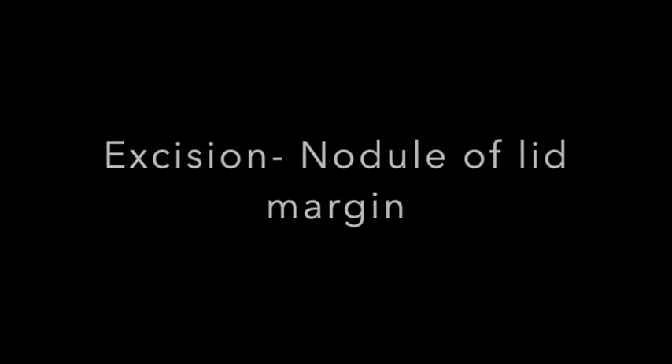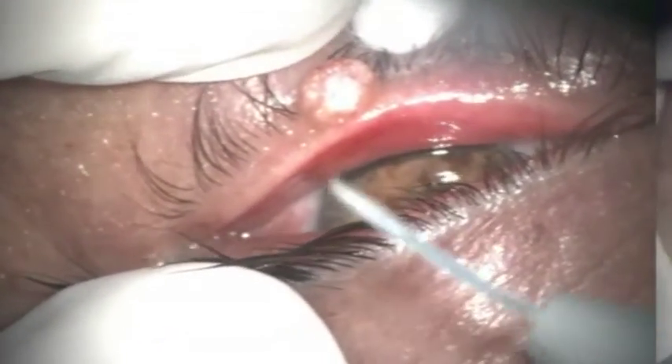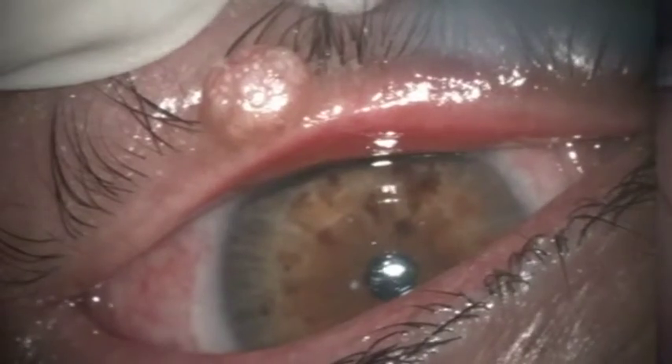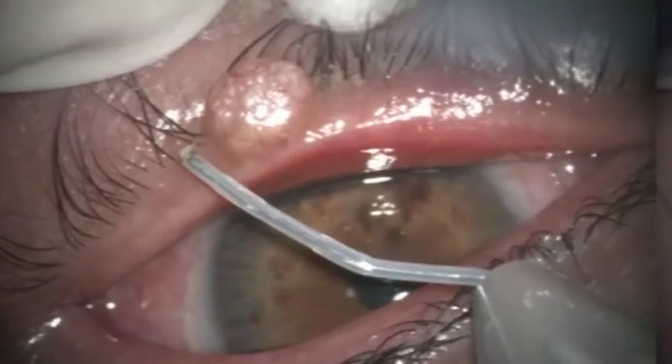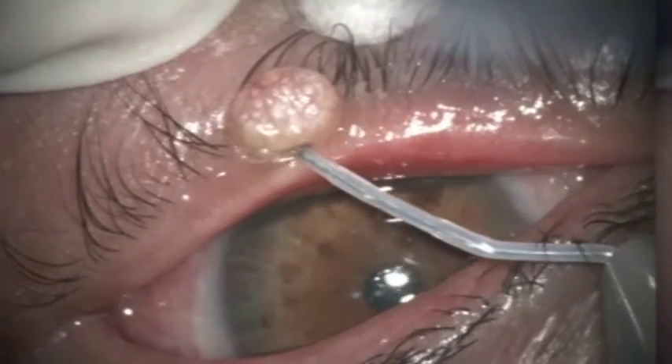Excision of a nodule of lid margin of six month duration looks like a very minor thing from the point of view of a surgeon, but it is so important from the patient's point of view. We do not know the pathology of this lesion, so we have to remove it for histopathology, and this is how I do it.